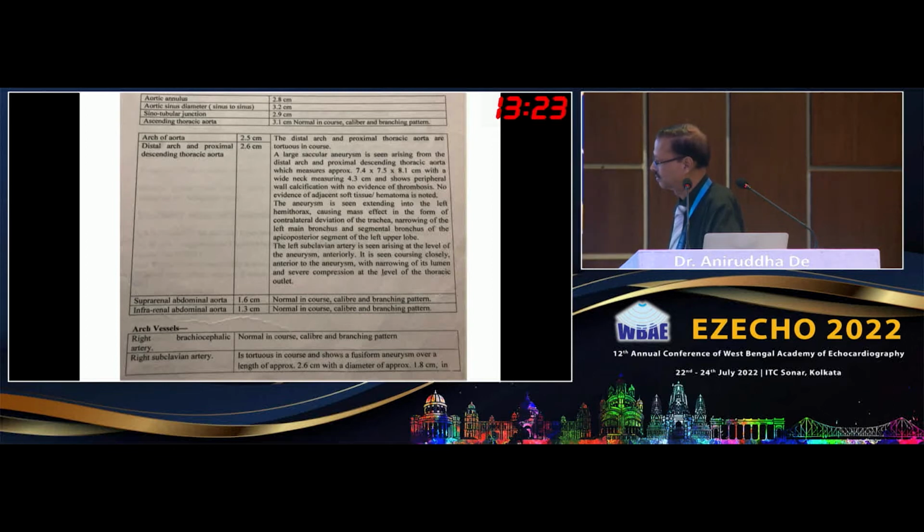I mean, it's simple. It takes me 5 minutes to do it from the femoral artery, and it will solve the problem. That's why I actually inquired why they didn't do the angiography properly, because this patient was being seen in 3 important hospitals. And before that, I will do a TEE. Actually, TEE is also a much simpler way of solving this issue. In fact, I would have seen the neck much better. The TEE probe will definitely be in the arch, that is, in the descending aorta, with all 3 aneurysms.